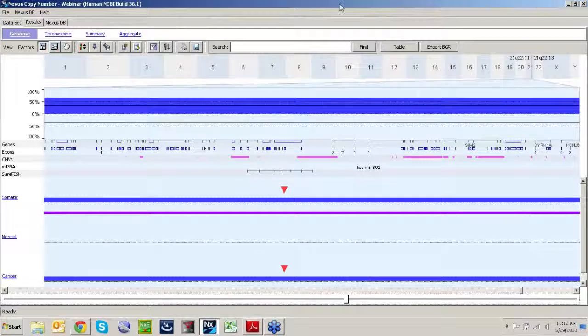Okay. So I do have some time. I wanted to go over one last case review. As you may be aware, with some case reviews we have a lot of information.